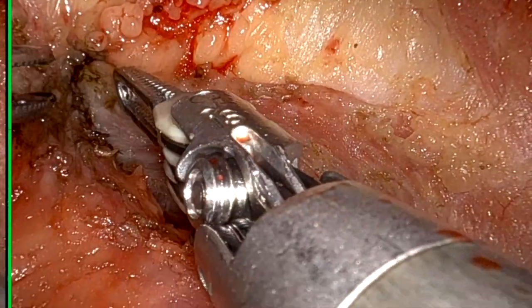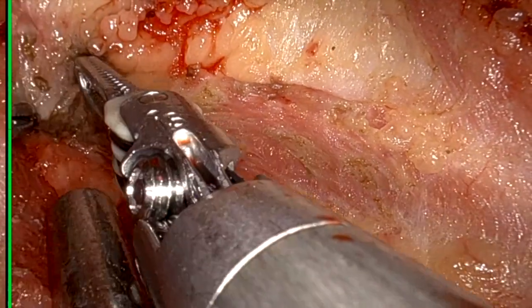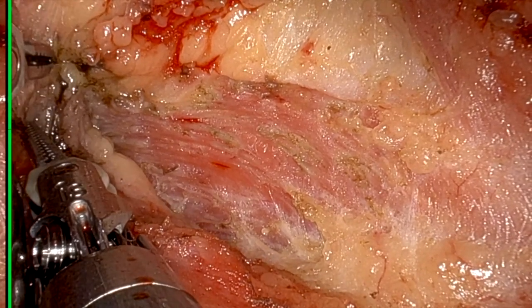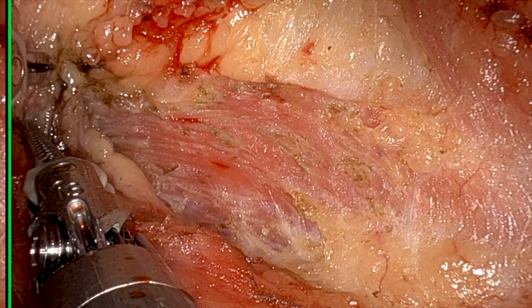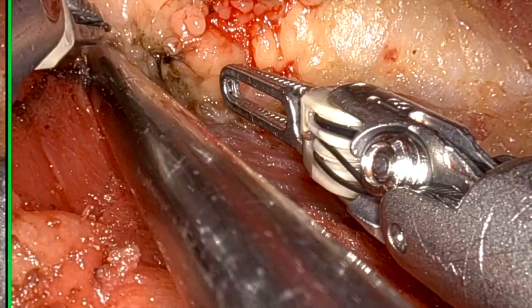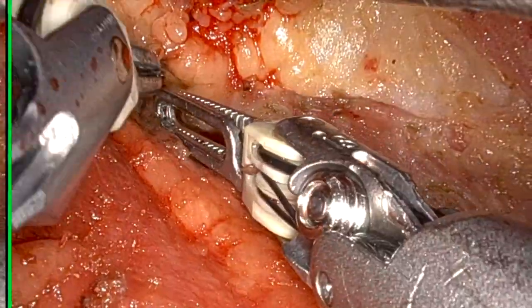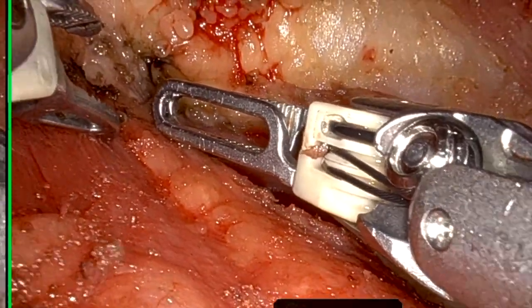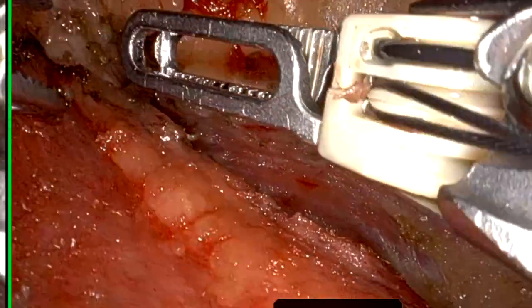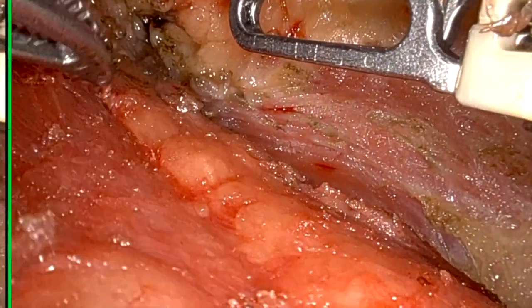Now I think I have reached up to the mandible, which is the superior most point. And I asked my assistant to help me locating the mandible. So follow the suction. So he told me this is the mandible. With the help of suction, he told me this is the mandible. And this is level 1A, the tissue of level 1A. So to get better vision, I zoom in my camera like this. This is level 1A.